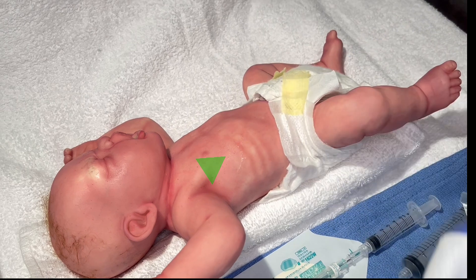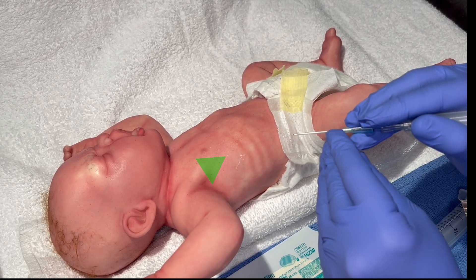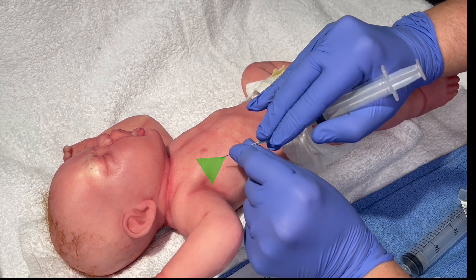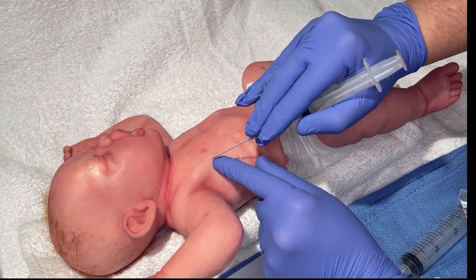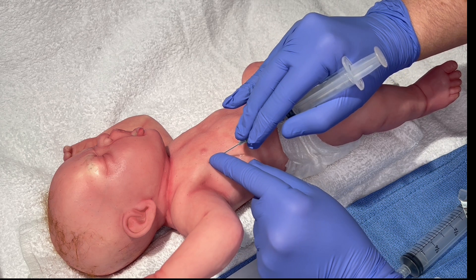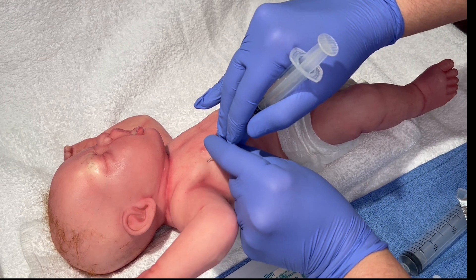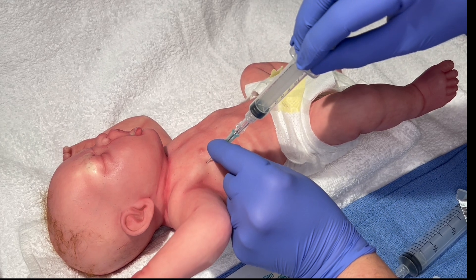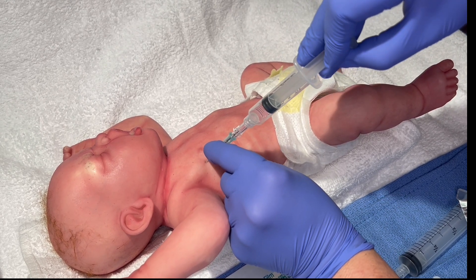Again, fourth intercostal space, anterior axillary line. You now take your IV catheter, bevel up, syringe attached. Locate your landmark once again. Go through the skin at a 45-degree angle, and then angle up to a 90-degree angle. You would now advance the needle and the catheter while pulling negative pressure on the syringe. You stop advancing when you get air in the syringe.